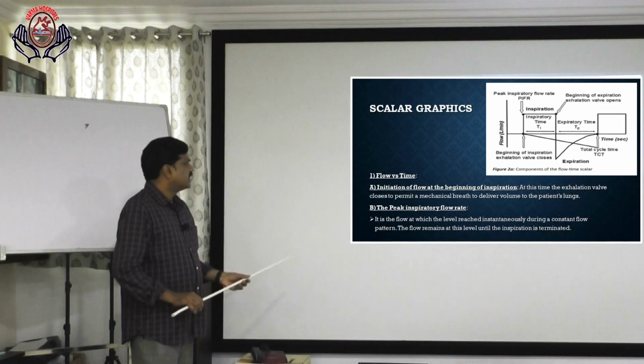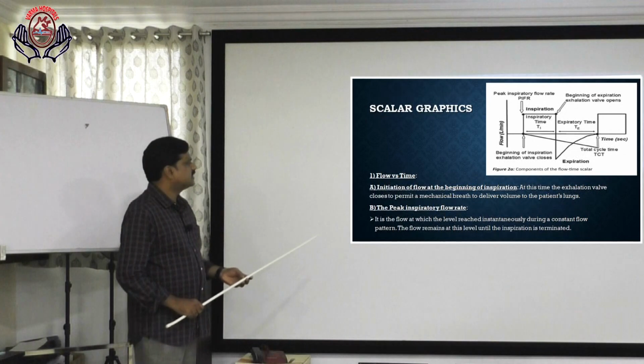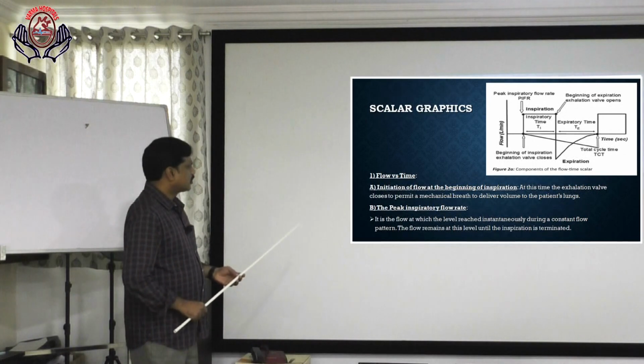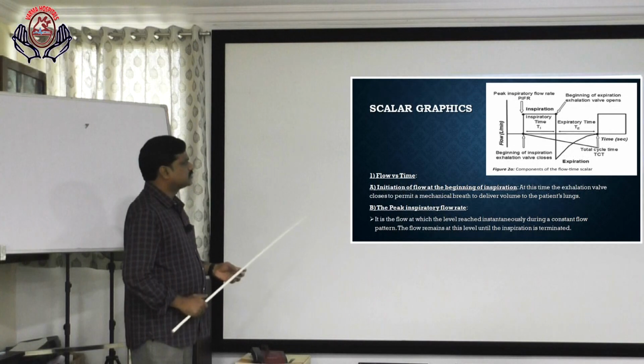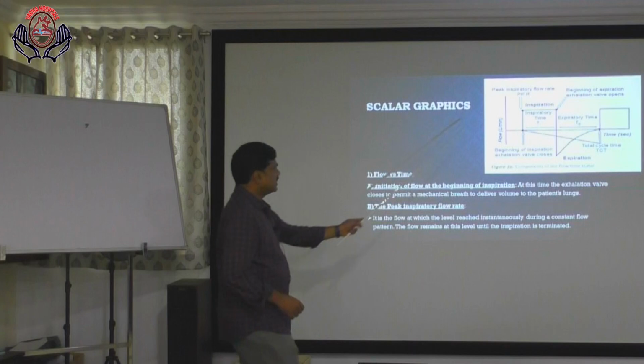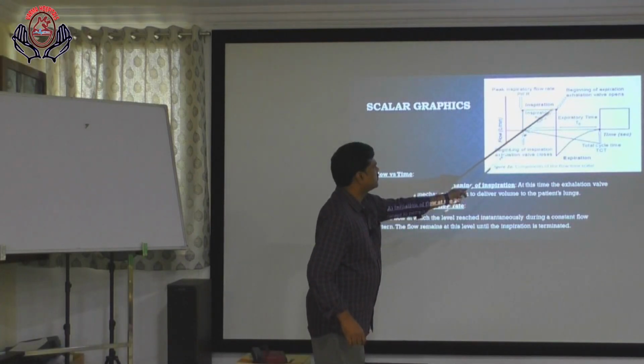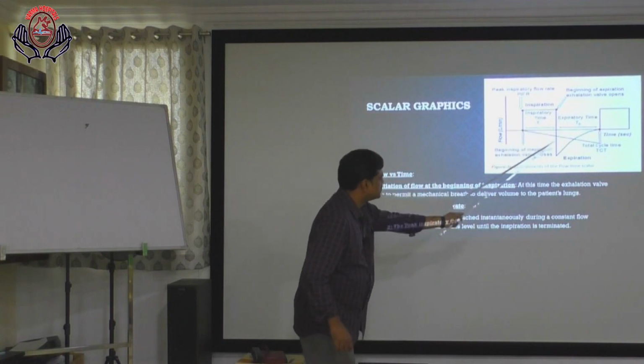Flow versus time: the initiation of flow at the beginning of the inspiration. At this time, the exhalation valve closes to permit the mechanical breath to deliver the volume to the patient's lungs. This is inspiration. At the beginning of the expiration, the valve opens. This is expiration.